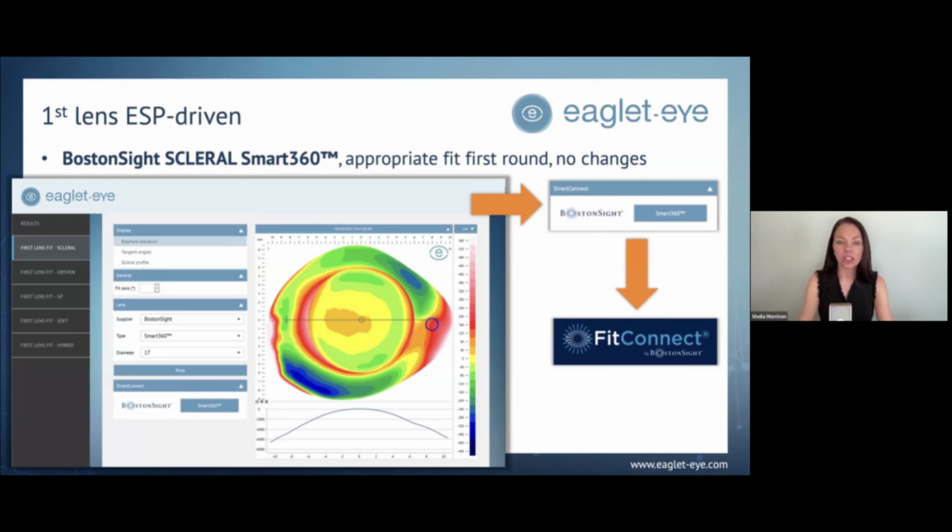And in the clinic, we actually take a measurement before we order an HOA lens. The purpose of doing that is to determine if a patient is a good or bad candidate for HOA correction at all. Some patients will complain about a ghost and the answer is not HOA. Maybe the answer is something else that's going on, something about their ocular surface or a bit of a cataract or whatever it is. We need to make sure that before we upgrade patients into a lens that is more costly, in all cases, actually, a little bit more sophisticated, that we're likely to have success. So we do a measurement and I'll show you what those measurements look like in a slide or two, just so that you can see our process for how we fit.